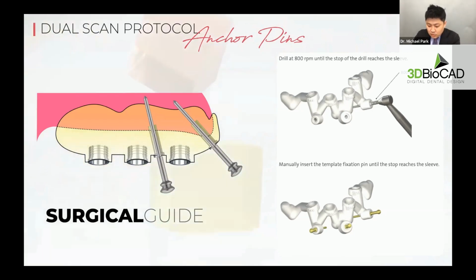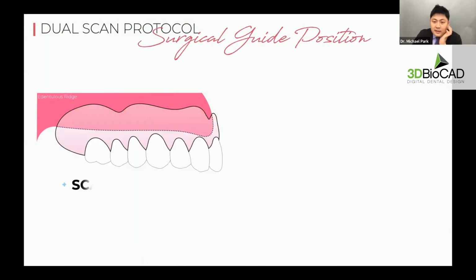However, I want you to know that just because we're using anchor pins, it doesn't mean that the surgical guide is in the right position. So how do we make sure that the surgical guide is in the right position? We'll go over that shortly.